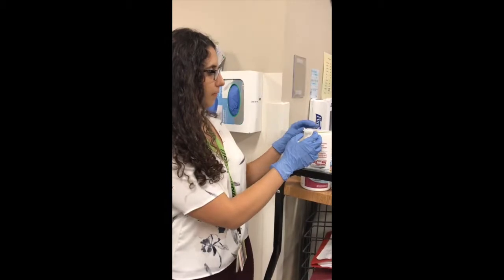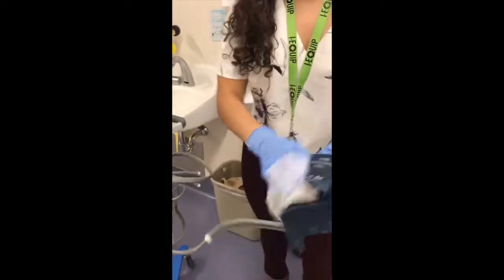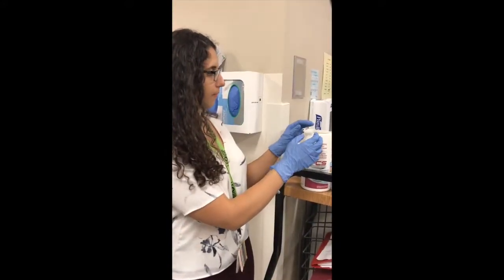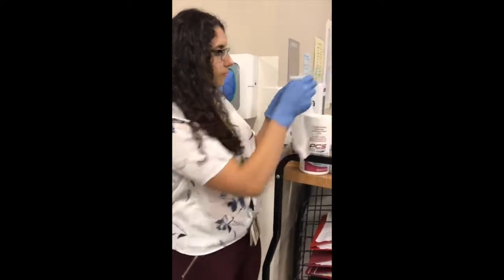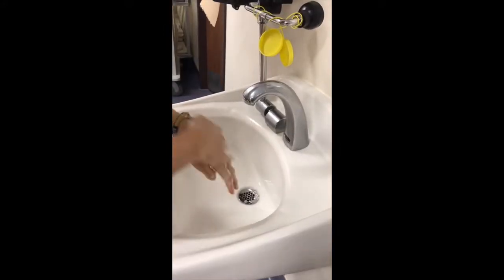To clean the blood pressure cuff, first put on gloves, then taking a PCS 5000 wipe, apply rigorous pressure to clean the inside of the blood pressure cuff. Next, taking another PCS 5000 wipe, clean the outside surface of the blood pressure cuff, being sure to apply rigorous pressure. When finished, be sure to dispose of gloves and perform hand hygiene.